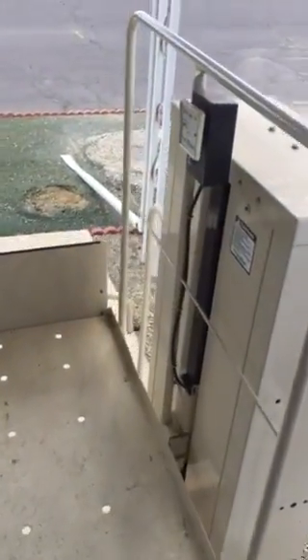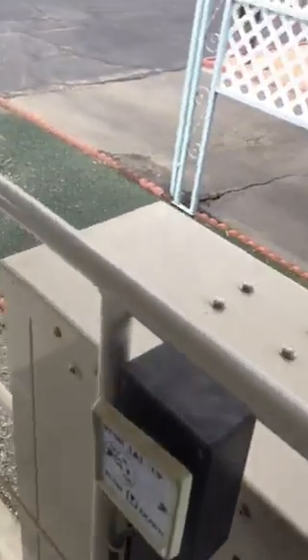All right, a MAC LP150 lift. We push it here — there it goes. It's adjustable up to 72 inches. This one, all we need is 24 inches.